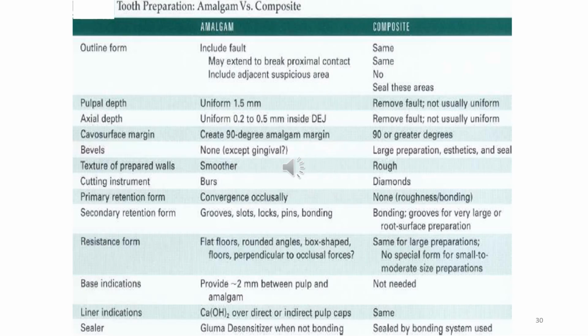Coming to the conclusion of my lecture today, I would like to provide a table which will tell you all the features required for a class 1 dental amalgam cavity preparation. To conclude my lecture, this is the table which I'd like to present in front of you, depicting all the steps of the cavity preparation of a dental amalgam cavity versus a composite cavity.